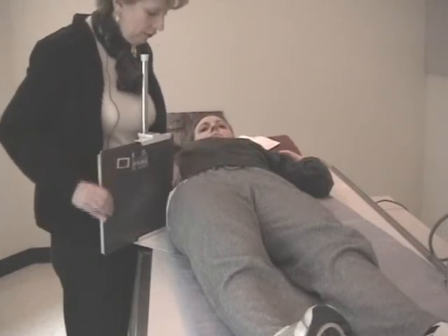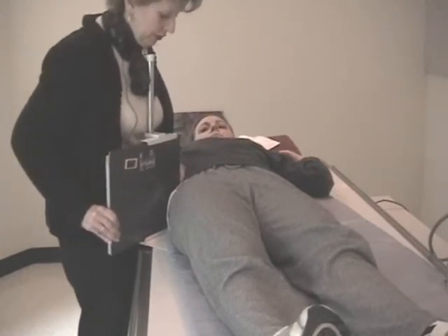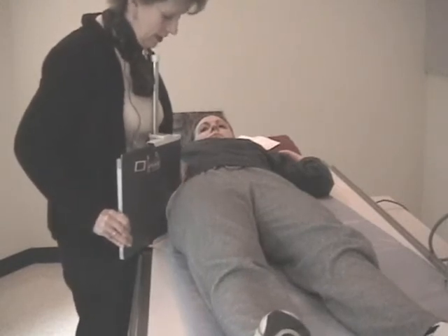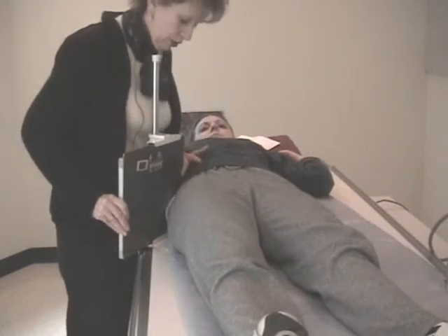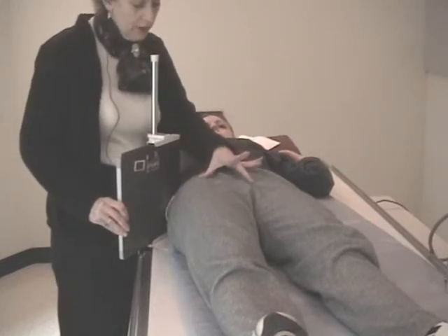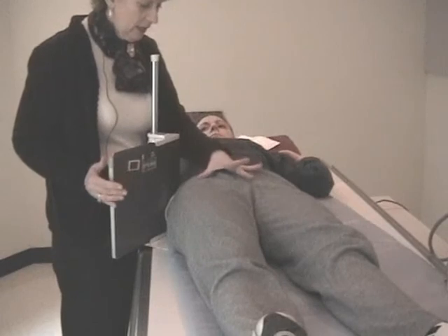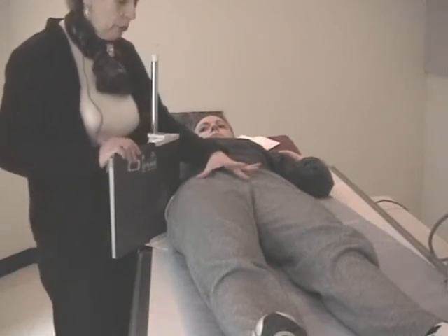And this edge of the film goes into the patient's waist, just above the iliac crest. Okay? Iliac crest, push the film in, find your imaginary line, and angle the film away from the body until it is perpendicular to that line. Why is that important?